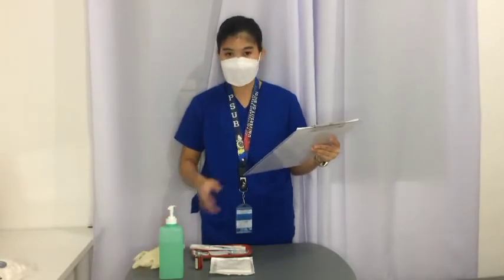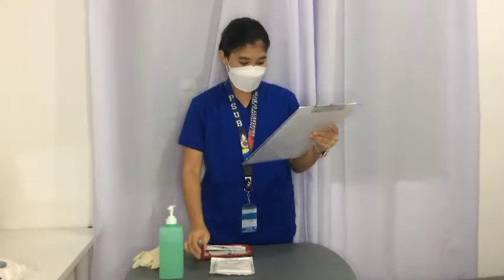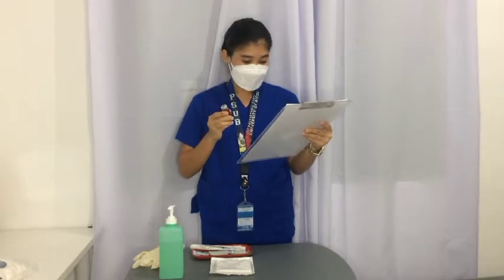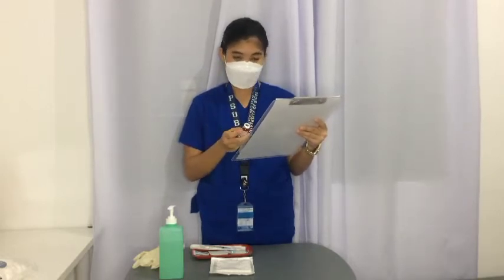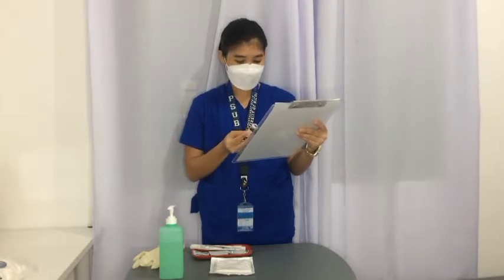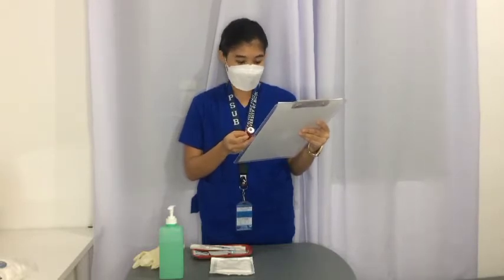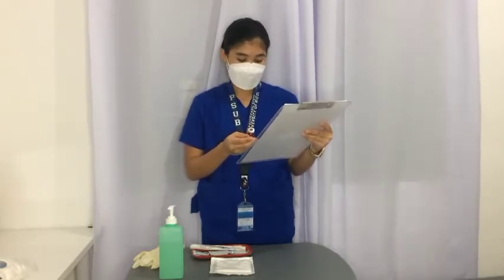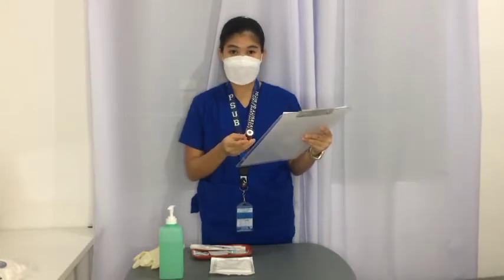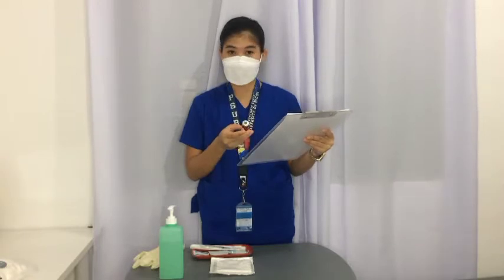So next is check the medication administration record. To check the MAR, we check the label of the vial carefully against the MAR to make sure that the correct medication is being prepared. Next is follow the 3 checks for administering the medication and dose. So read the label on the medication when it is taken from the medication card, before withdrawing the medication and after withdrawing the medication. And also, after checking it, confirm that the dose is correct.